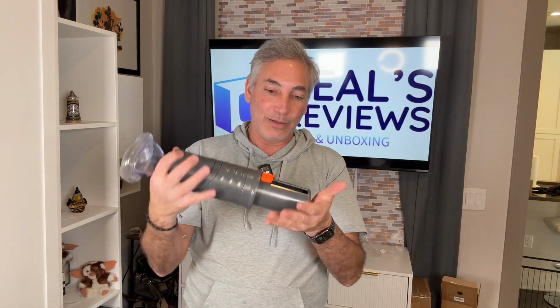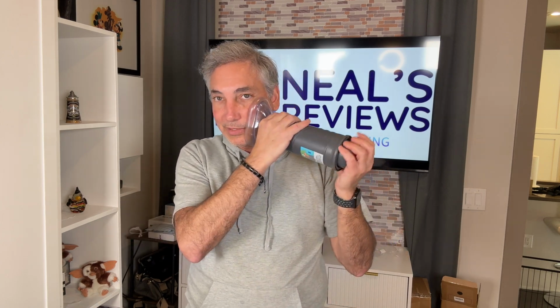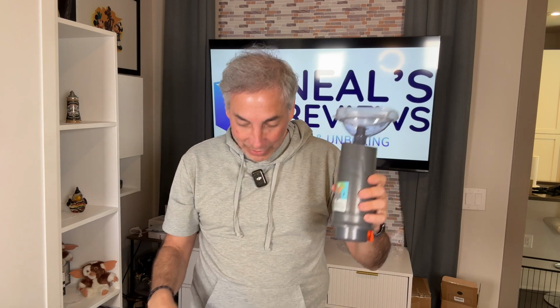So that's what it does, it's pulling all the air out of there. I'm afraid to do it on myself now. I'm not choking, so I don't want to necessarily pull all the air out of my face. I'll stick it on the side here and just do it. Oh, gosh, that really sucks. So that'll suck all the stuff out of the person's throat. So that's what it's good for. So that's kind of how it works, is you have it on there, they push the button, and it pulls whatever dislodges it from their throat.